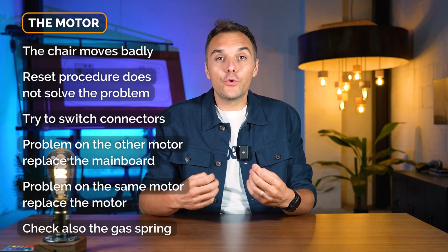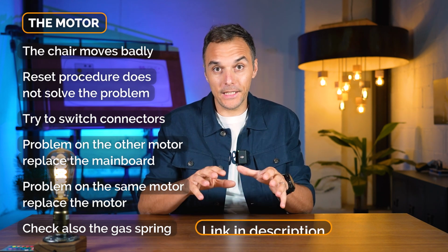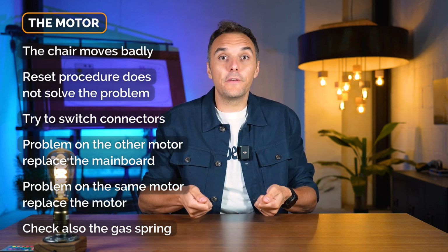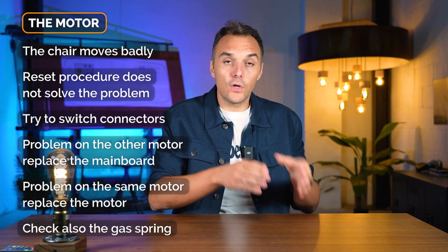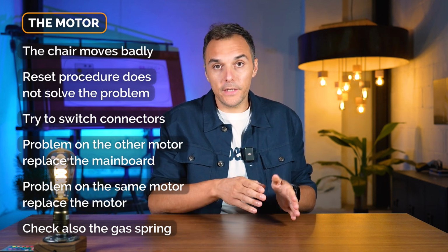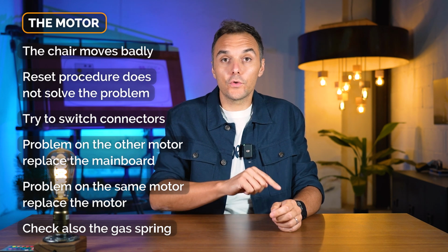In this case, you need to be careful when you remove the motor, so please follow the instructions, because you need to put the dental chair in a secure position. First of all, you can easily see if the gas spring is working or not, because if it's working, it's very easy to lift up the dental unit, even if you are one person. If it's not working, the dental chair is impossible to lift up because it is way too heavy. So in that case, you need to remove and replace the gas spring as well, and then replace the motor, because the motor got damaged because the gas spring was not working.